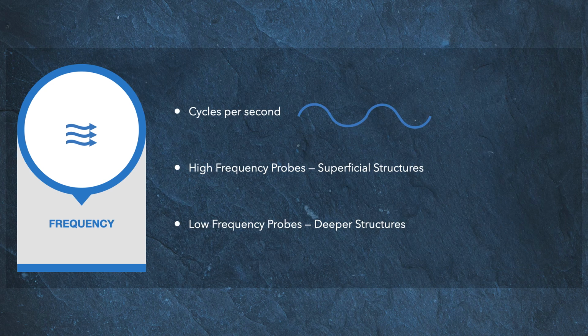As you all likely recall, the frequency of a sound wave is most simply described as the number of cycles of a wavelength per second. This becomes important with ultrasound imaging because the frequency has an impact on the appearance of your images.